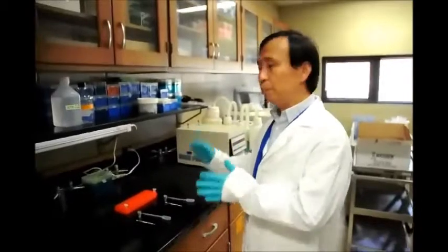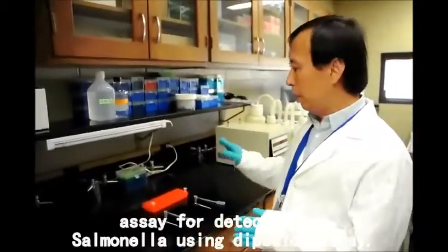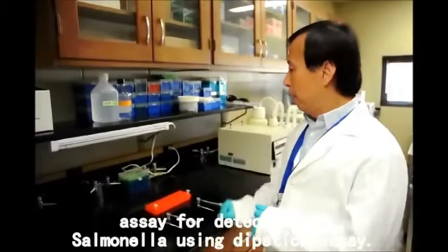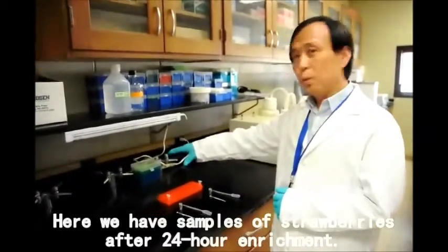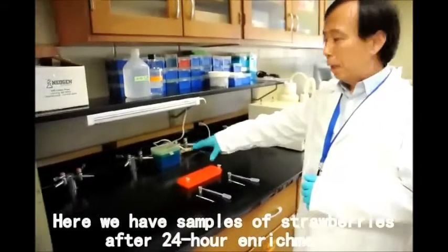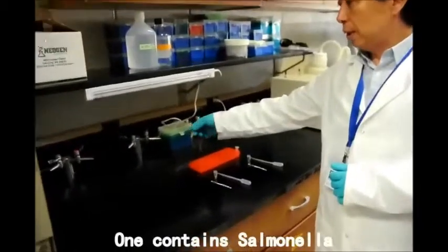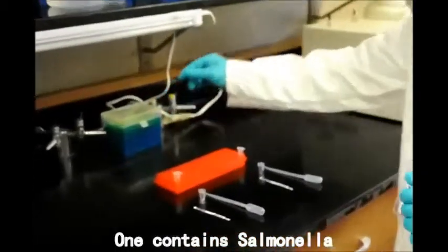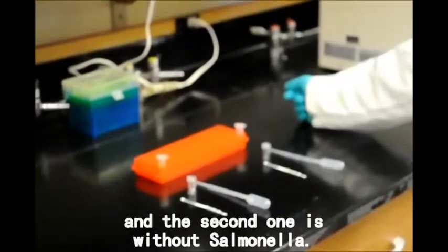This is a video demonstration of the assay or detection of salmonella using a dipstick assay. Here we have a sample of the strawberry after 24 hours of enrichment. One is the sample with salmonella and the second one is without salmonella.